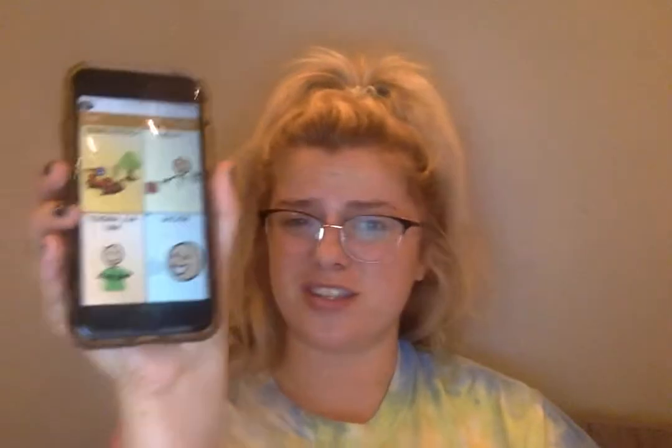Hi. Today I'm going to be discussing a speech generating device. The specific speech generating device that I will be talking about today is TouchChat. TouchChat is a software that is used on Apple products. So today I'm going to be using it on my iPhone. This is an iPhone 8, and you can download it on an iPhone, on an iPad, or any other sort of portable Apple product. If you're not an Apple person, they also have a Samsung product called NovaChat. And it's basically the exact same thing, just depending on what company runs it, either Apple or Samsung.